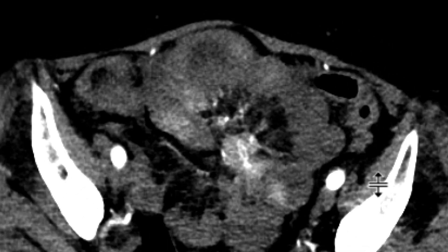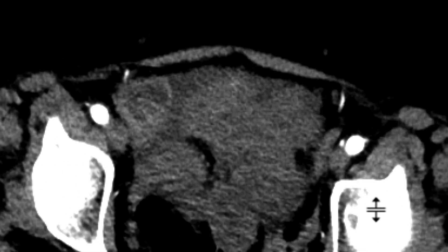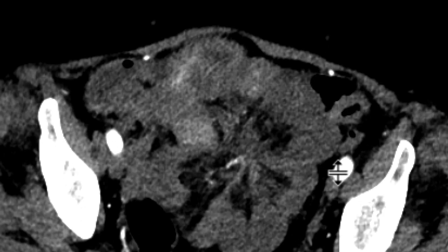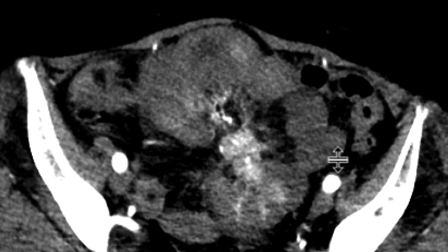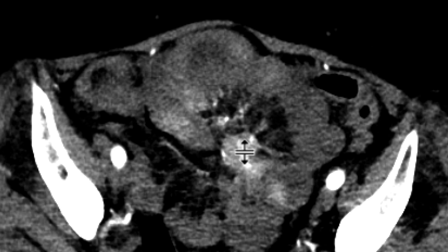We can start to appreciate that some of these bowel loops have low density within them — probably just fluid — but some of them also have this high-density content. There are other foci visible here and elsewhere as well.